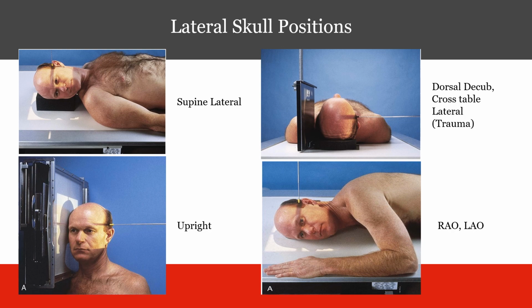So there are different options for the lateral skull positions. The patient can be in a supine lateral, they can be upright, they can be in a dorsal decubitus with a cross-table lateral, or they can be in an RAO or LAO position.